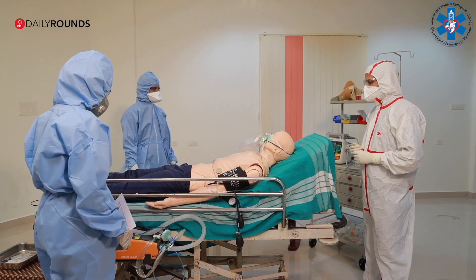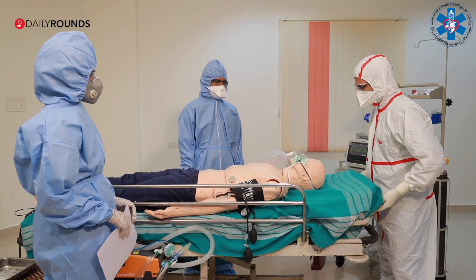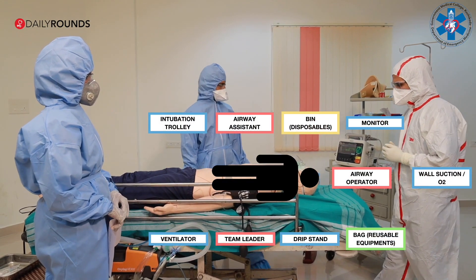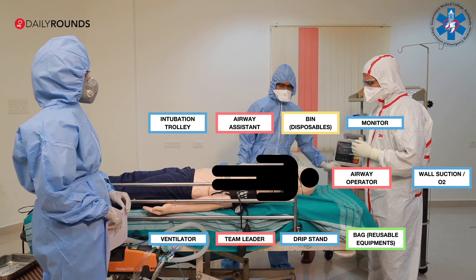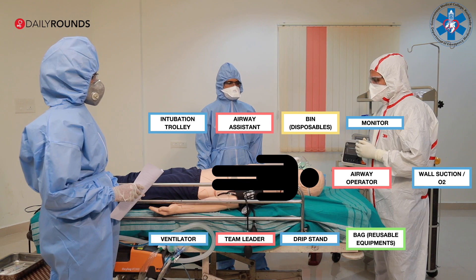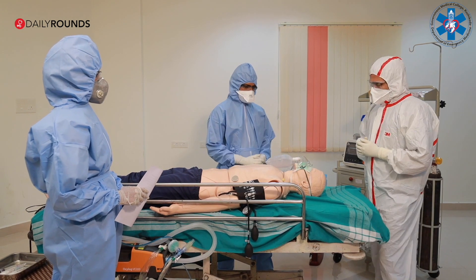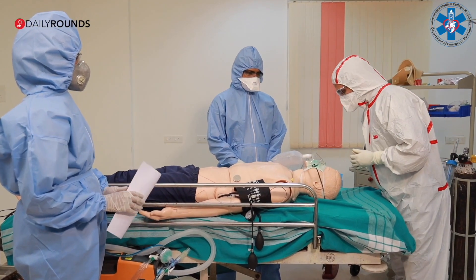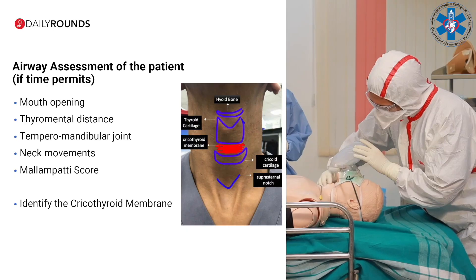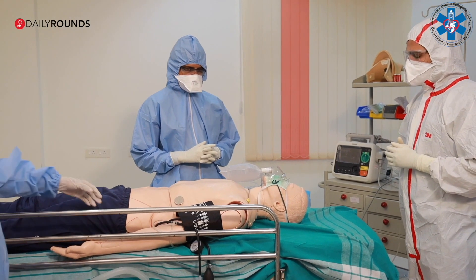Once you enter the room, assess the situation and touch as little as possible to avoid fomites. The intubator should be at the head end, the airway assistant to his right, and the team leader who administers medications and monitors to the left. A quick assessment of the airway should be done to look for possible difficult airway. Identify the cricothyroid membrane as well. Ensure two functional intravenous access points.